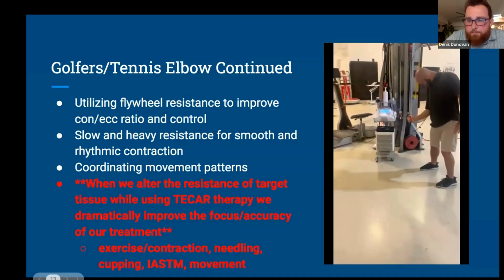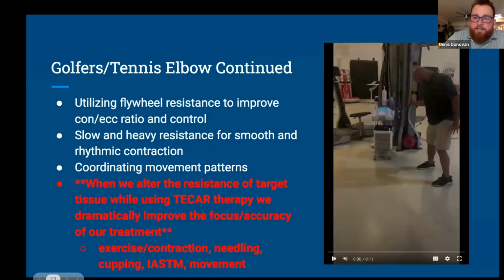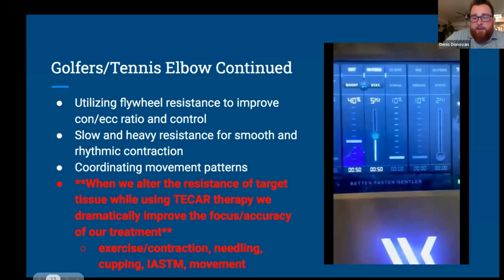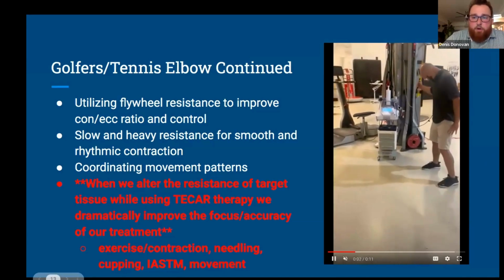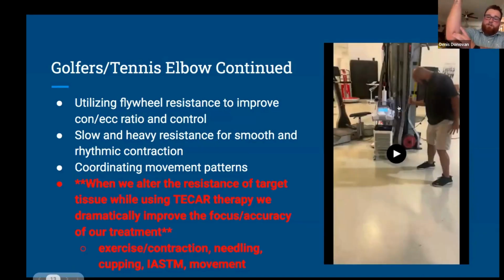Now, this gentleman was having a little bit of medial elbow pain, not really related to tendinous injury or anything like that. But what I did is I have, again, the ground handle, and I have an adhesive applicator over his scapular area. What was really cool about this, and I'll play the video one more time, is that he wasn't feeling any heat at his scapula, wasn't really feeling any heat at his hand, but where he was getting a concentration of current was right through that medial compartment of his elbow, which is exactly where we wanted it to go. And during the downswing, that's going to take some of the stress of the swing.